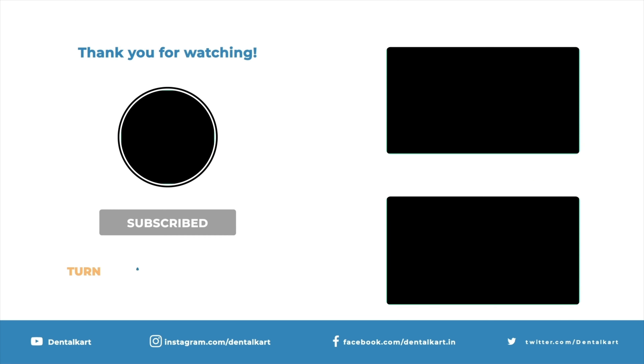Mandibular premolar forceps are used for the extraction of the first and second premolars. They have identical broad and open beaks that are longer than those of the mandibular anterior forceps.